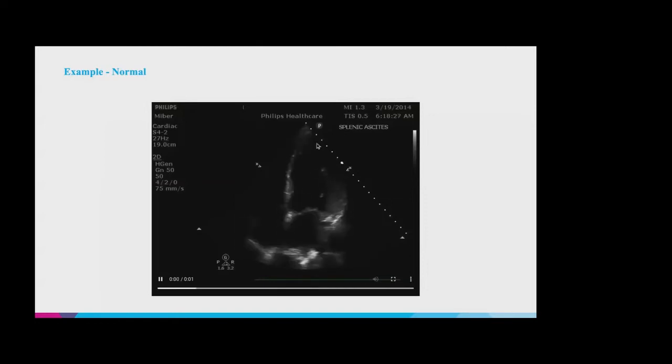or less. Another important tell to keep in mind is, especially when we're looking at an apical view, the left ventricle should be the only thing in the apex of the heart. So even if this sliver of the right ventricle looks small, but if it creeps up into the apex, that's abnormal, and that would suggest RV dilation or RV enlargement.